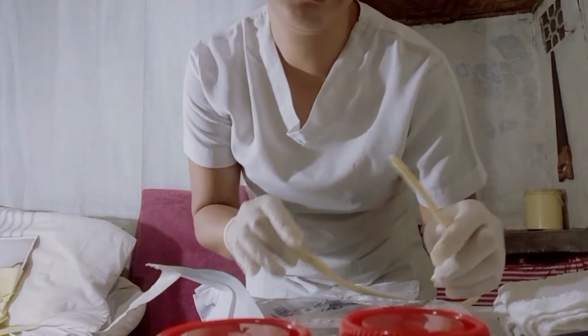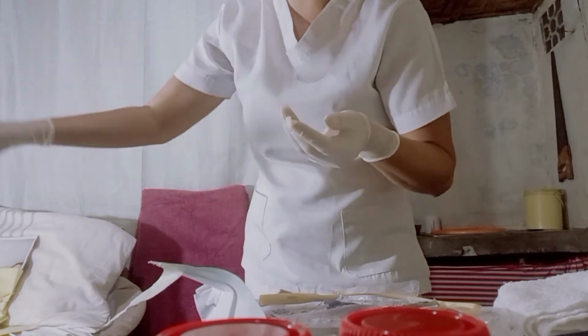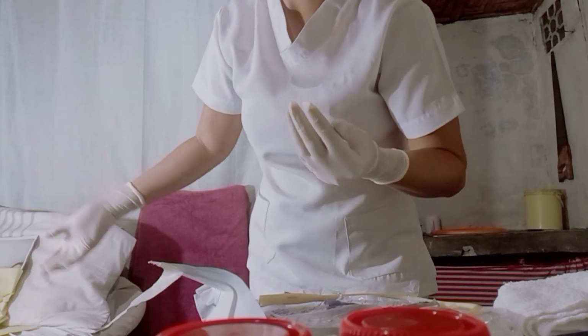Remove the fenestrated drape from the lid and place it on the perineum such that only the labia are exposed, or discard the drape if you prefer. Rationale: expands the sterile field.